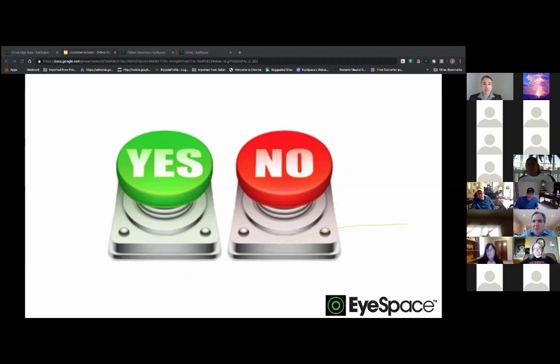So no matter how many times you tell patients, they don't listen. So it's always great to physically put them in, put a shoe on that foot, and let them experience the process. That would be a good time to start discussing monovision, and will they be capable of handling monovision? Do you try and put some aspherics into the optics to create a bit more of a multifocal effect? That's when you start experimenting with stuff like that. Any other takes, Jagrut?